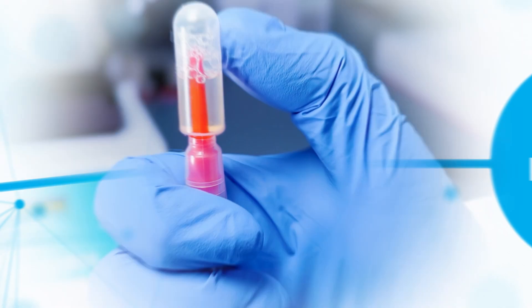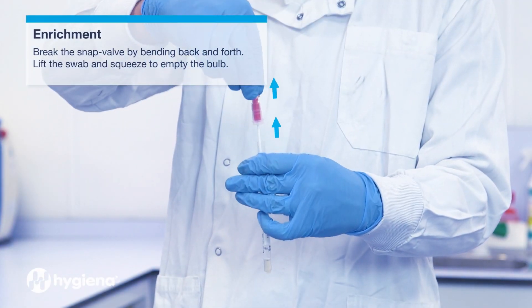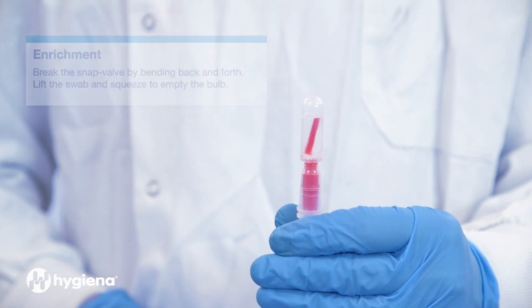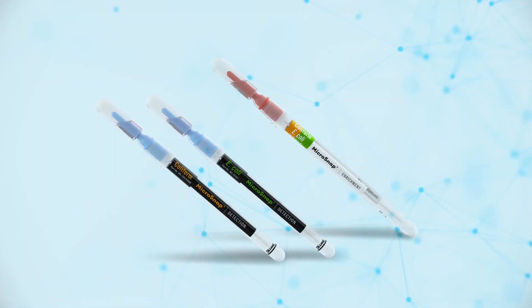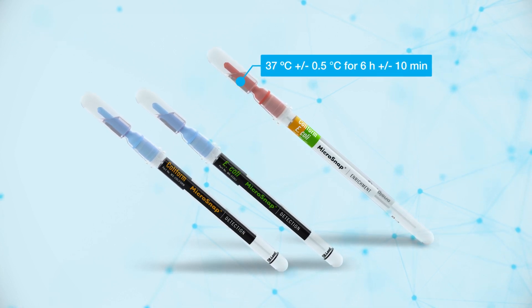Enrichment. Break the snap valve by bending it back and forth. Lift the swab and squeeze to empty the contents of the bulb. Reattach the bulb and shake gently to mix the contents. Incubate at 37 degrees plus or minus half a degree for 6 hours plus or minus 10 minutes for both coliform and E. coli.